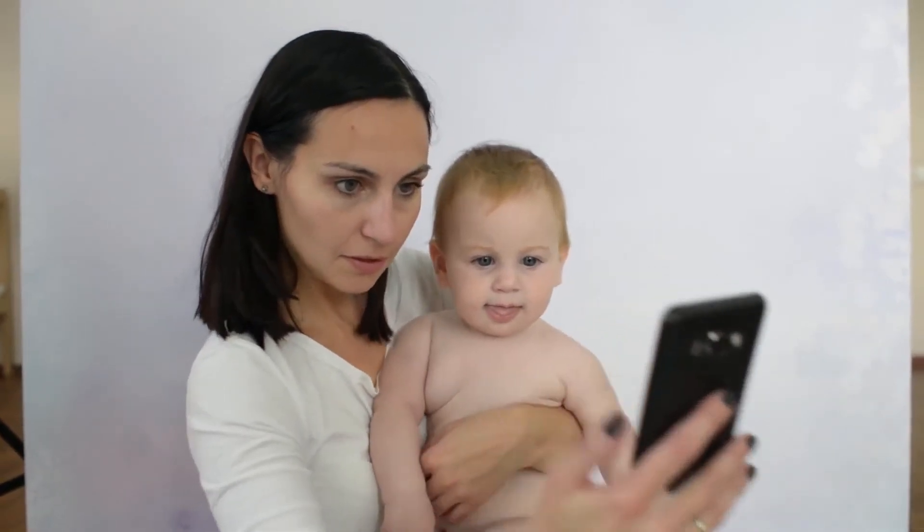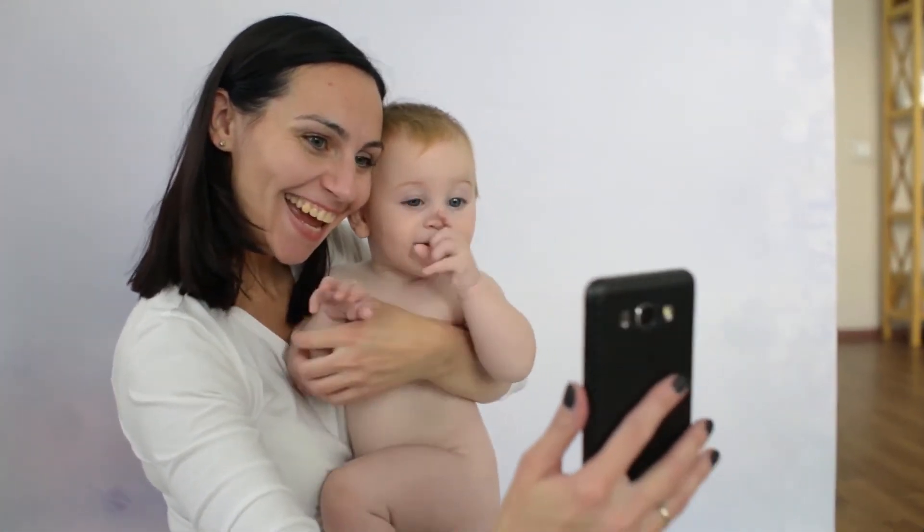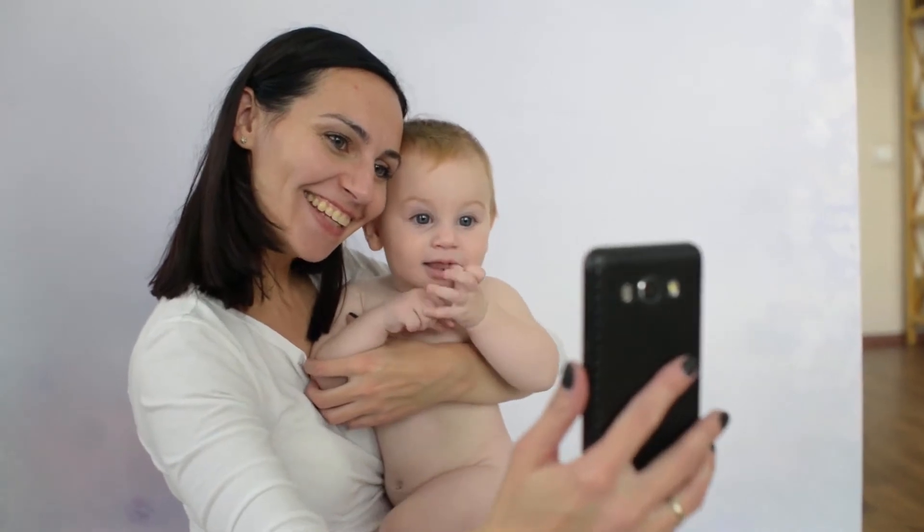Items included: a well-packaged baby nasal aspirator, 2 sizes of silicone tips, 1 USB cable, a storage box, and friendly customer service.